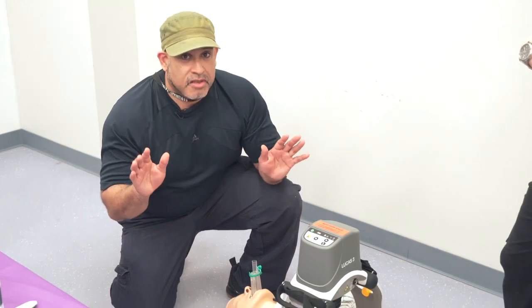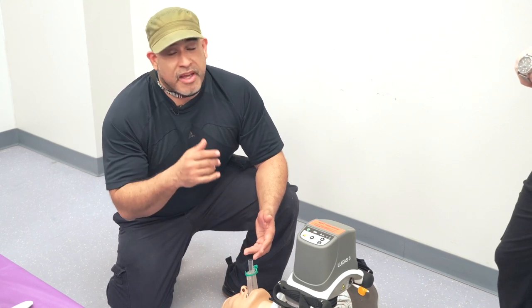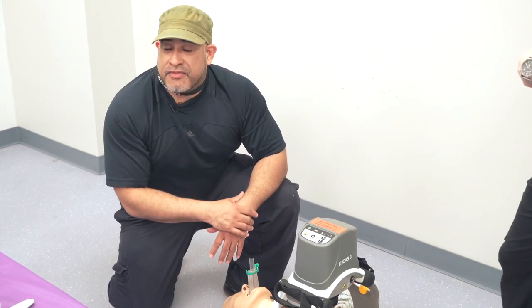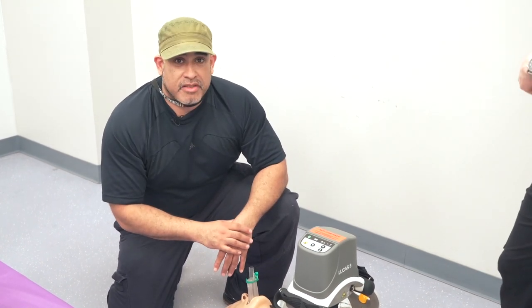Does that make sense? So make it simple while you don't have the staff, and maybe you only have time to put in the supraglottic airway while you put an IO in and start asking for, or putting in, orders on Epic. Make sense, guys?